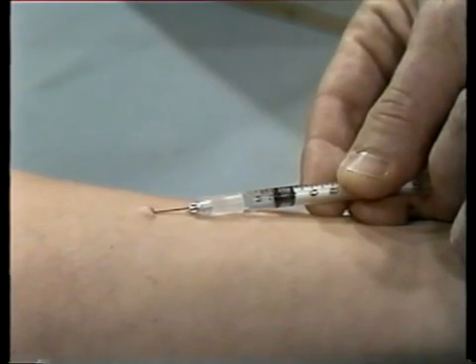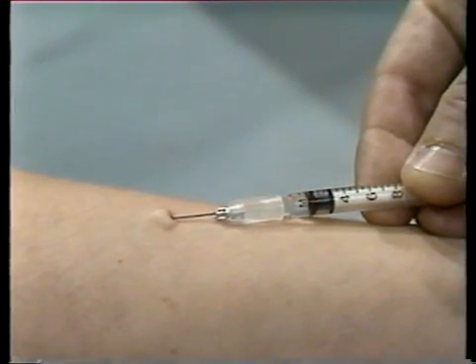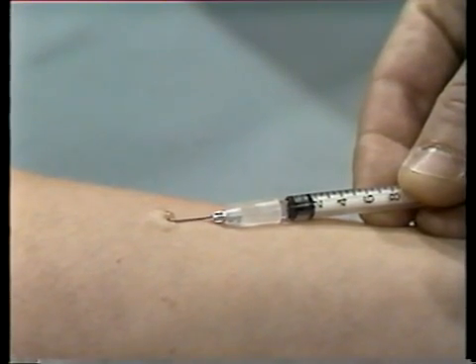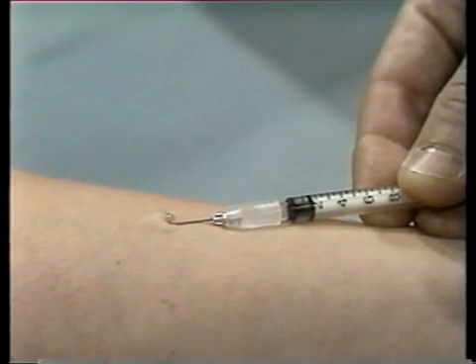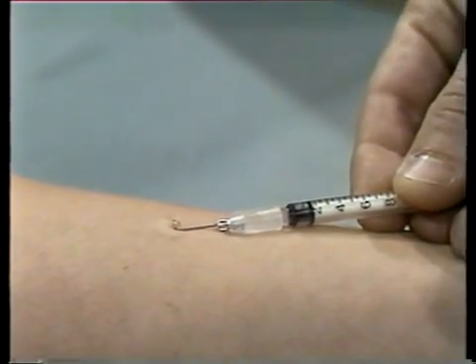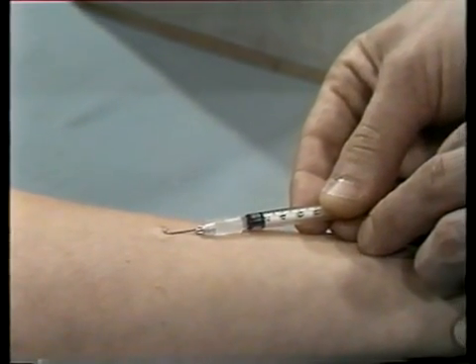Inject a small amount of solution. If you have inserted the needle correctly, a small white circular bump will appear on the skin. Inject the remainder of the solution slowly. The small amount of solution you ordinarily inject will remain in the circular bump under the skin.